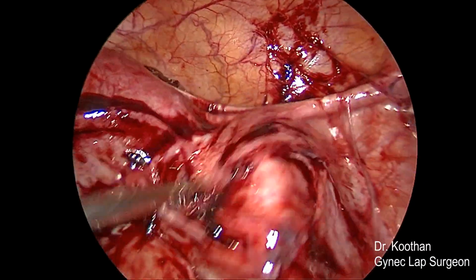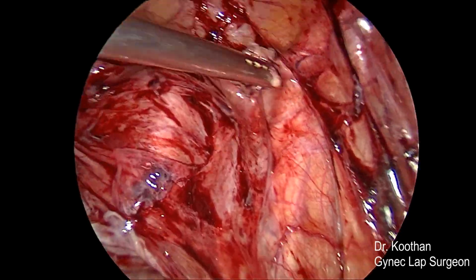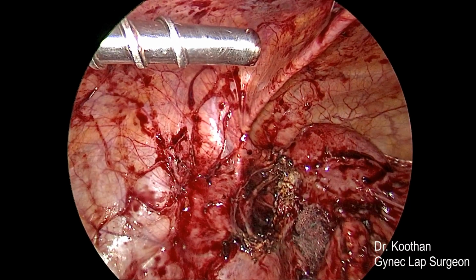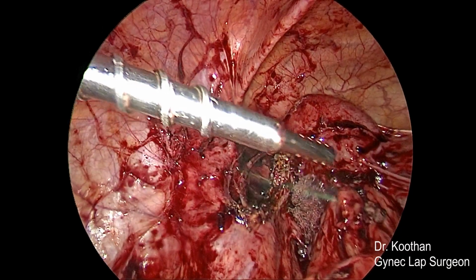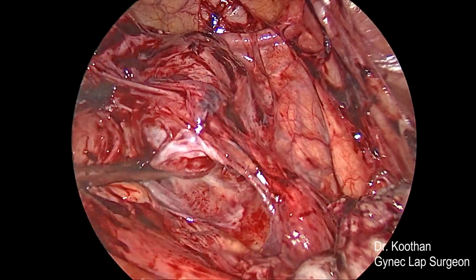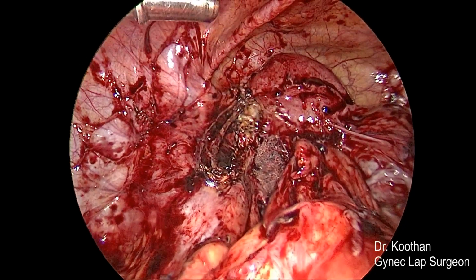And also you can note the Pyosalpinx adherent to the uterine wall. We have to be sure of the ureter on the right side.